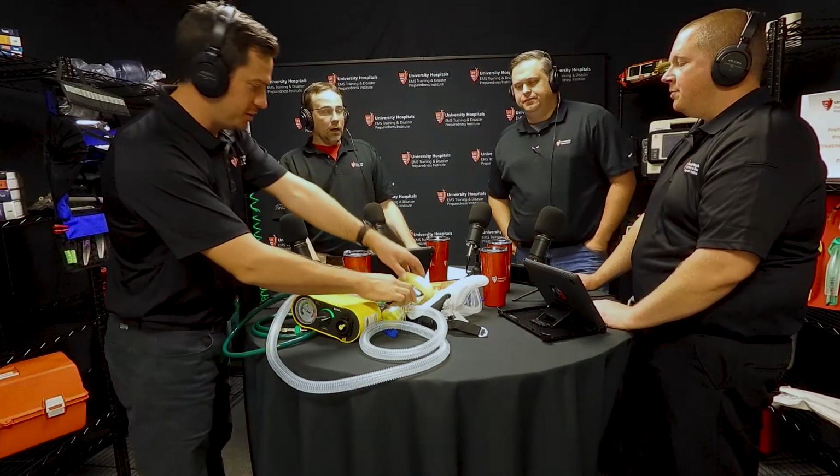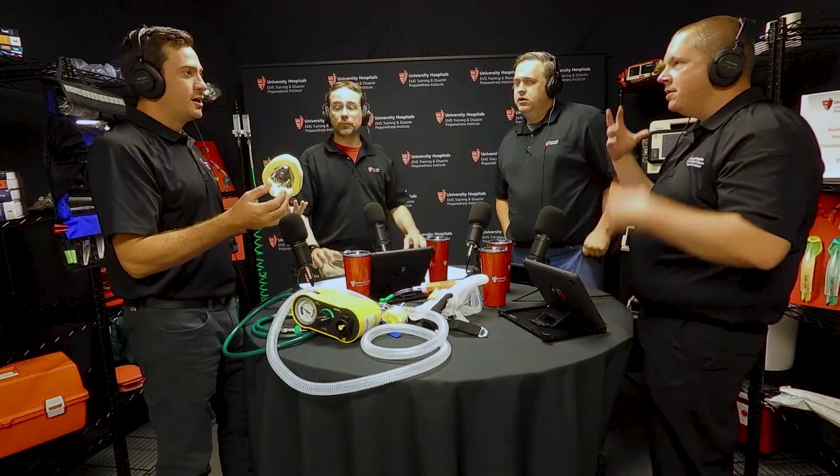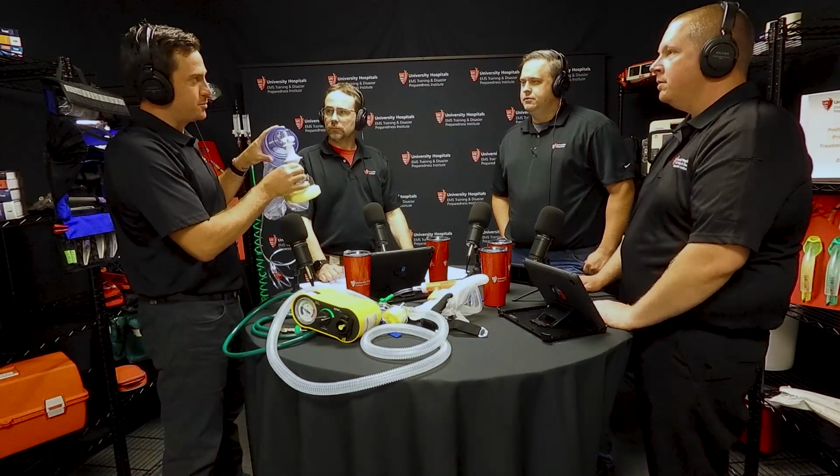Here's one of the beauties of putting on the CPAP headgear: you're not just holding something on. If I strap this to my patient's face and put my CPAP on and they don't tolerate it, I have now created a mask that I can be hands-free with my BVM. The transition is super easy.